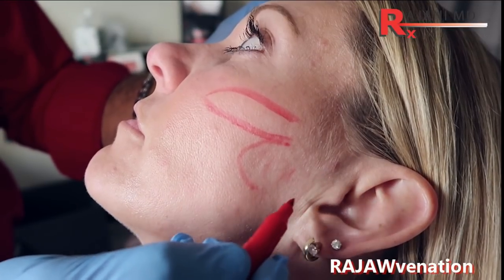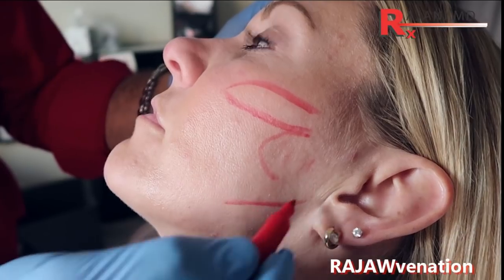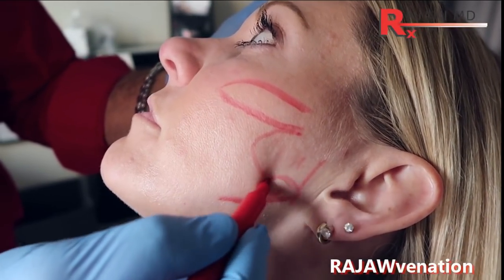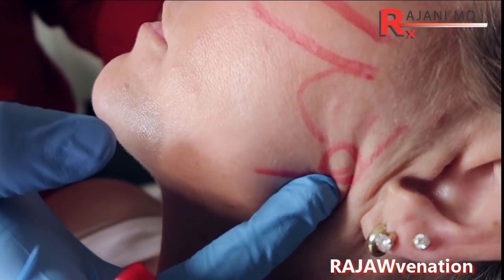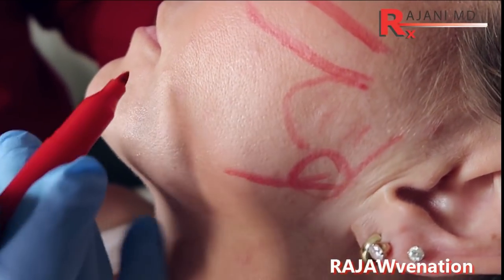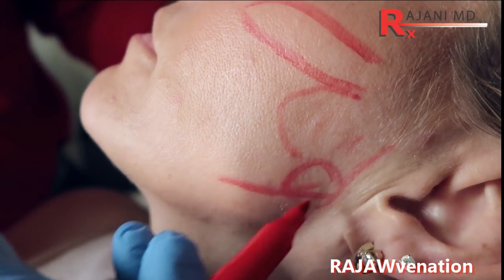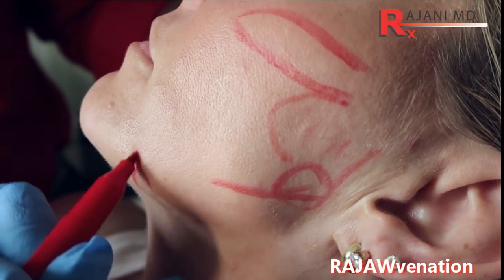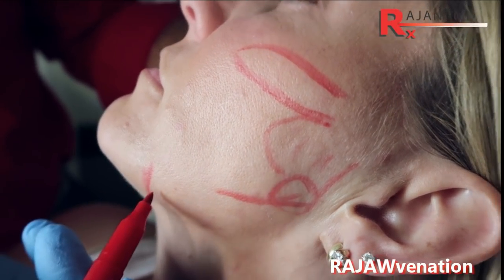You'll see some lines here — we'll fill through here. Right in this zone is really where we want to create volume. The idea is it's going to move the tissues back to help with the downturn of the mouth and recreate the volume lost at the angle of the mandible. If there is a pre-jowl here — minimal here — we won't have to address it today.